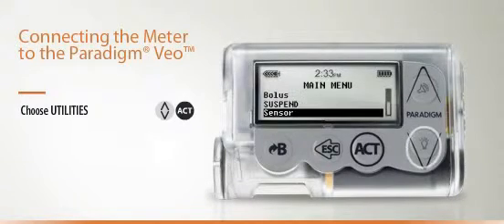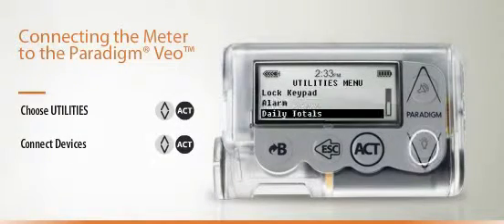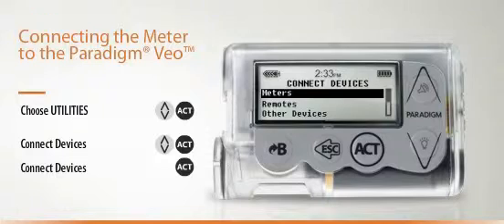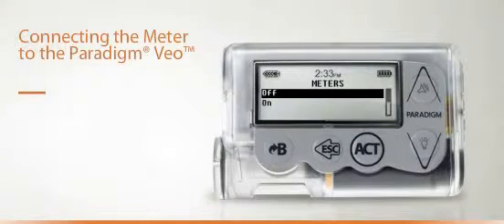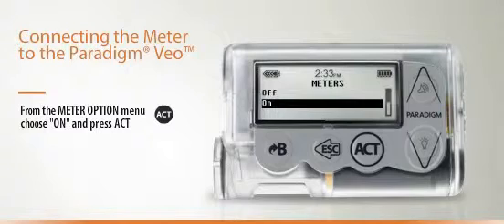Scroll to Connect Devices, then press Act again, and select Meters. You will now be asked if you would like your meter option off or on. Scroll down to On, then press Act.